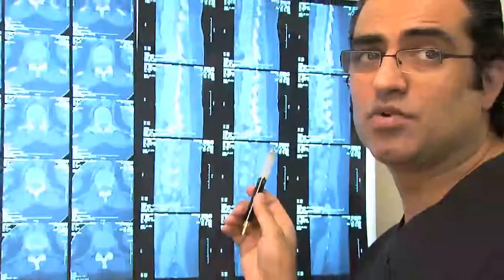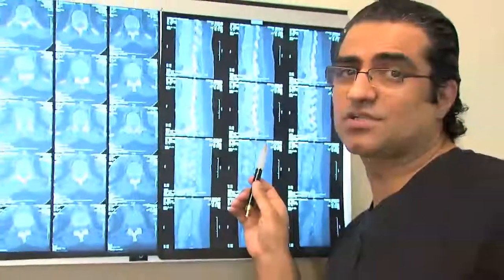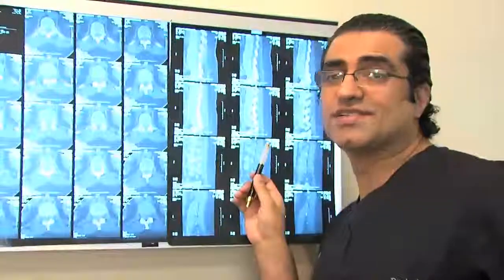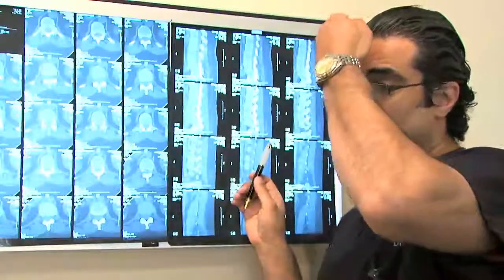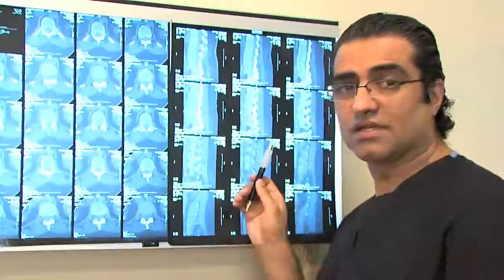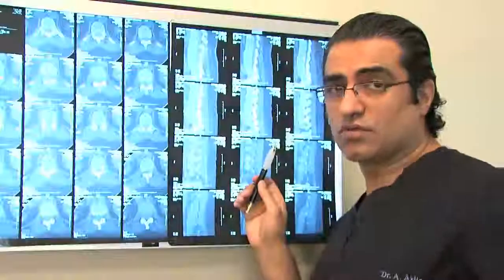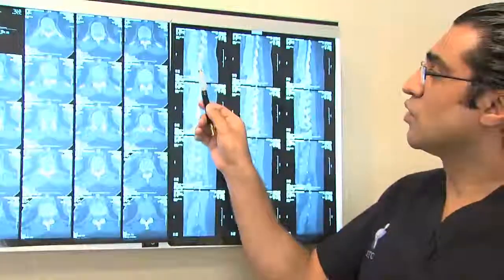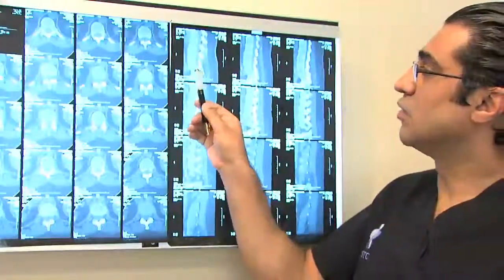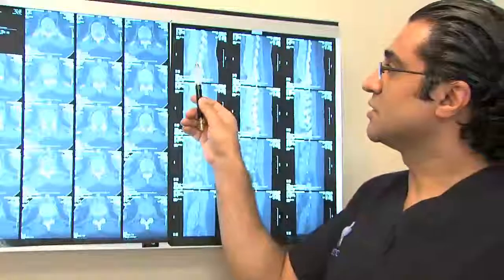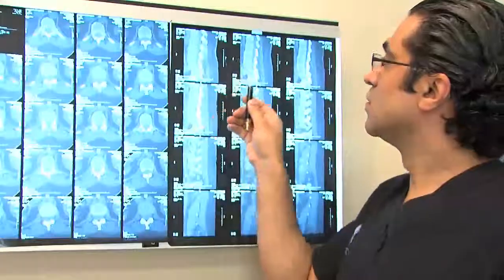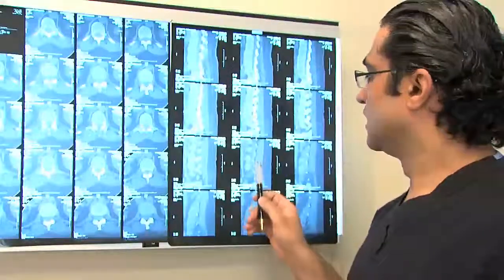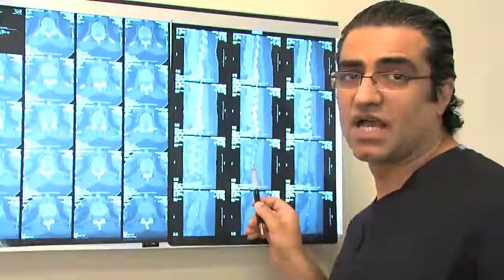This is an example of sagittal views — the slice of the body that cuts you in half, so you're looking from the side. You can see in this corner that it's going from the middle of the patient, with the slices going toward the left side.